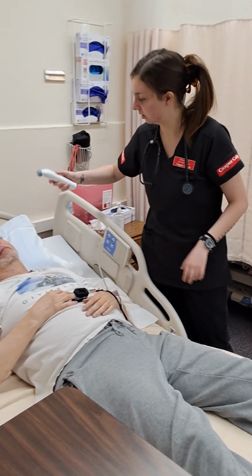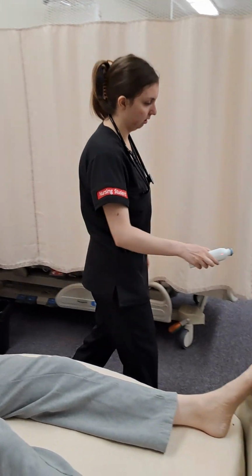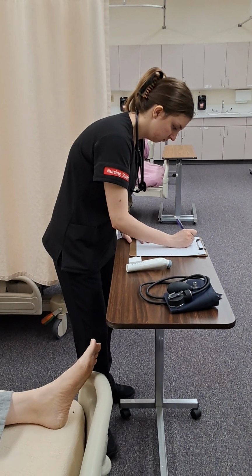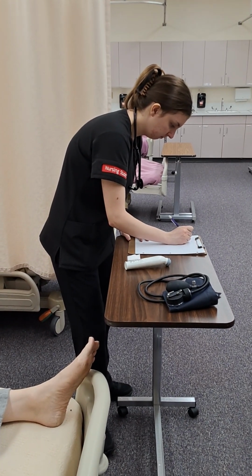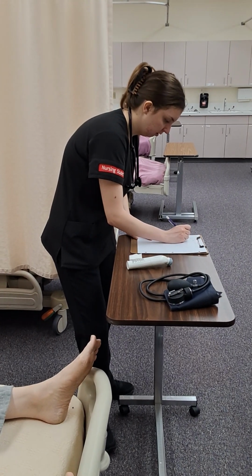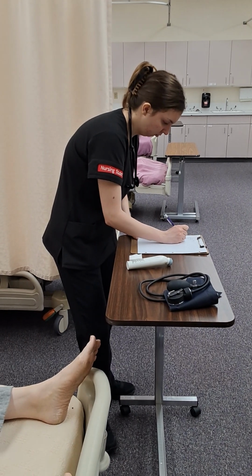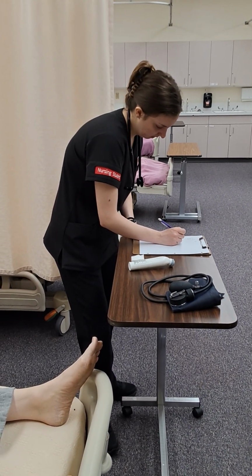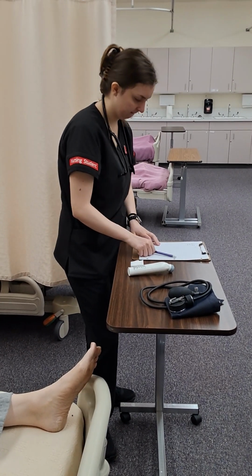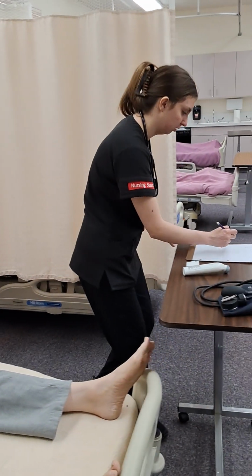I'm going to take your temperature. It's going to go on your head. Okay, 96. So I'm going to get a temperature, a blood pressure, a pulse, a pain assessment, a respiratory rate, and oxygen saturation.